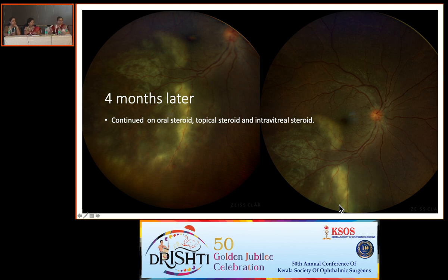Then would some other imaging modality help in locating it, like OCT, peripheral OCT or something like that? No, fundus photo will be the best, I think. Even I agree with that. I don't know whether another modality, like red-free or something, would be more useful. I'm not very sure, but fundus photo as of now.